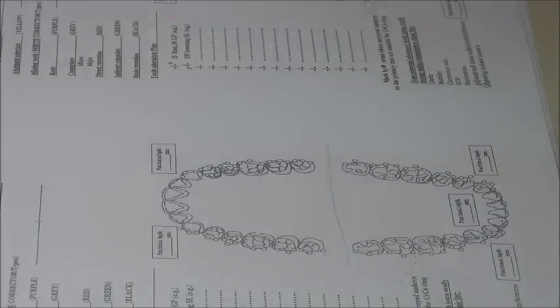Because every clasp design or clasp material has its own, and this came up in the exam. Every clasp type has a specific measurement for it. Okay? So the first thing is its relation with the survey line occlusally. Okay, let's try to find a cast. Okay, say this undercut, for example.